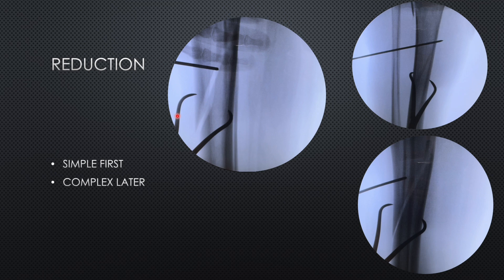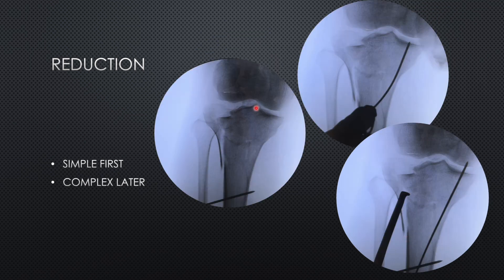We used a Weber's clamp to reduce the fracture and placed a K-wire so that the reduction remains secure while we manipulate the metaphyseal area. We have reduced the fracture in the diaphyseal part in AP as well as lateral view. Now we have to come to the metaphyseal or periarticular part. Once we have reduced the diaphyseal part, the medial condyle appears to be somewhat reduced.